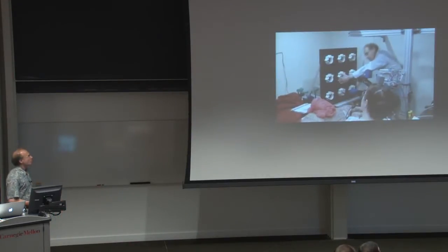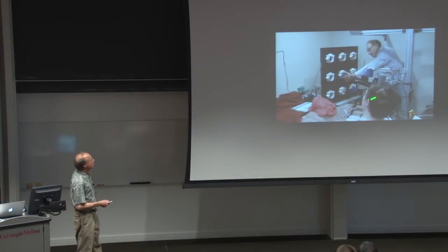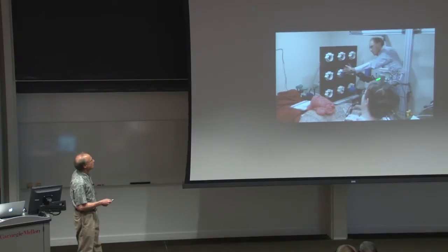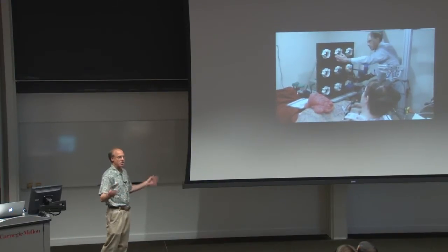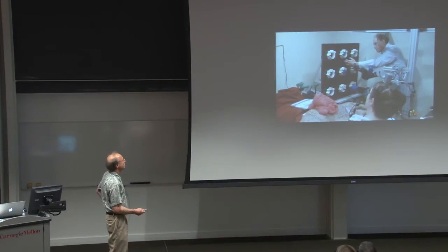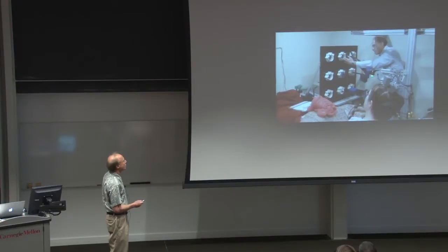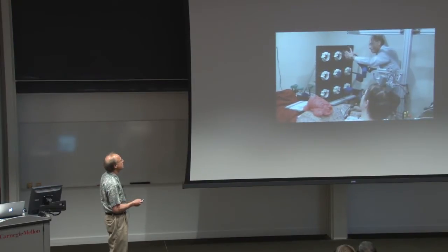Now, a few days later, she came to the lab. This was the second day of trying this. We have this arm I'll tell you about, this DARPA arm. And we just said, hey, think about moving this arm. Not a lot of training, no training, actually. Just think about as if you're moving your own arm. But she was able to do it within a few hours of trying. This is the beginning. Second day.